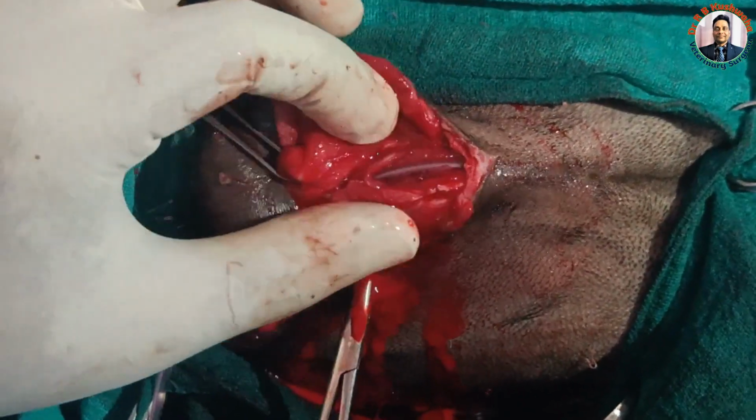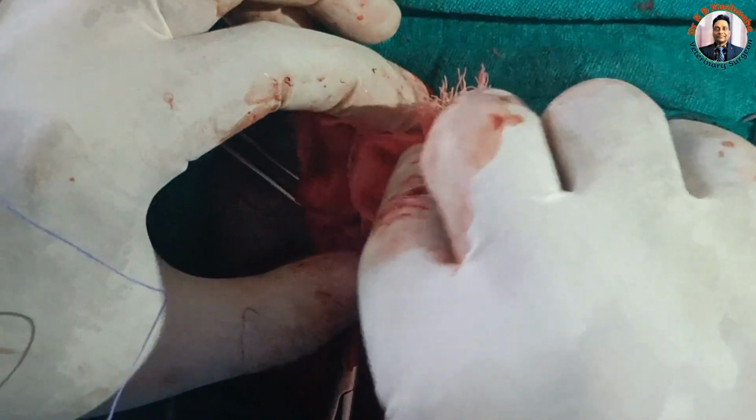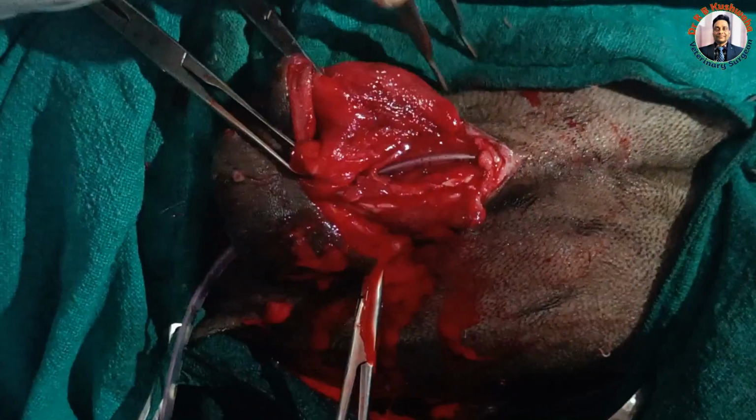So give the 2-0 polyglactin. It's better to start from the caudal side. So first here.